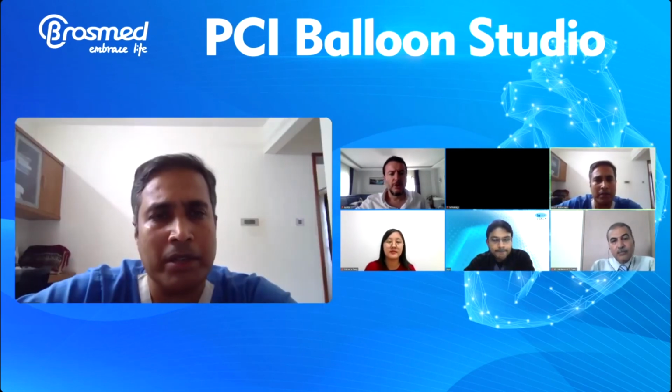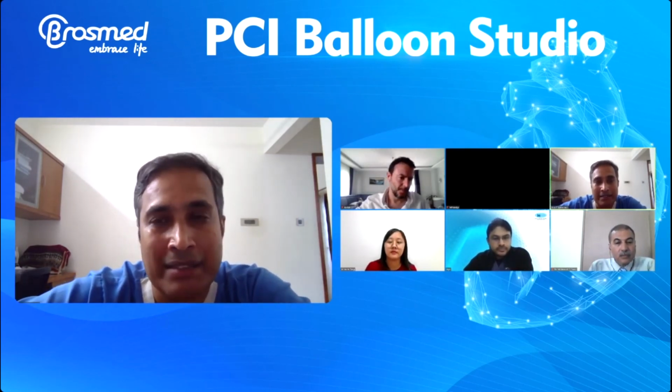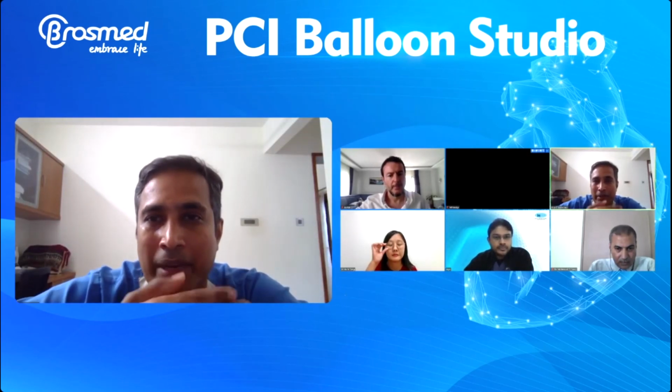It's a good balloon because of the case, especially the second one, where I had to go through struts and needed high pressure to break the calcium, and it was perfectly suited there. So, a different indication. It just doesn't break with higher pressure. That's the advantage, because otherwise, we're not going to stop at a 0.75. We're going to upgrade. So, that's it.